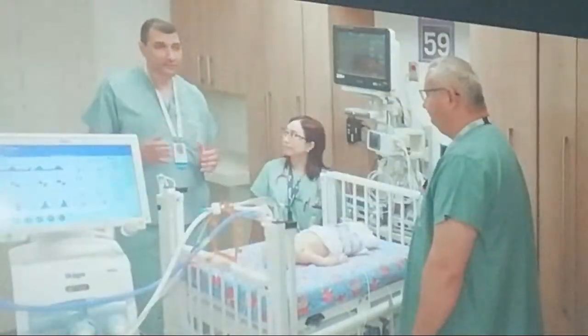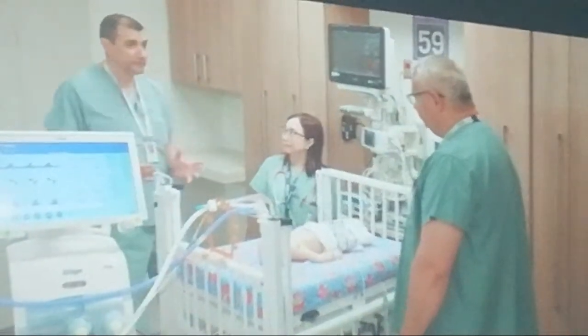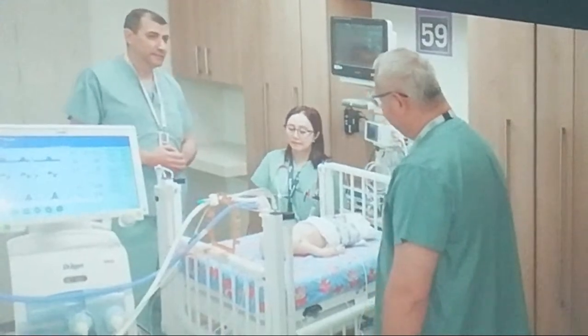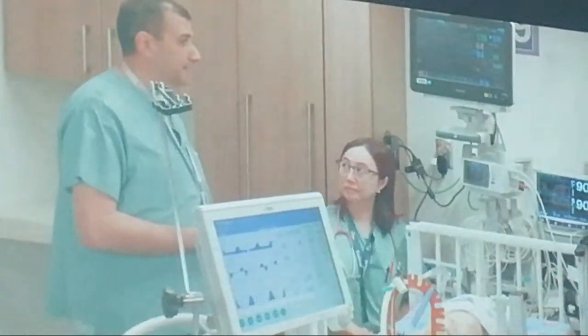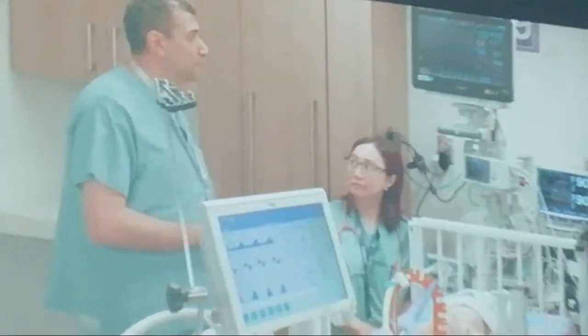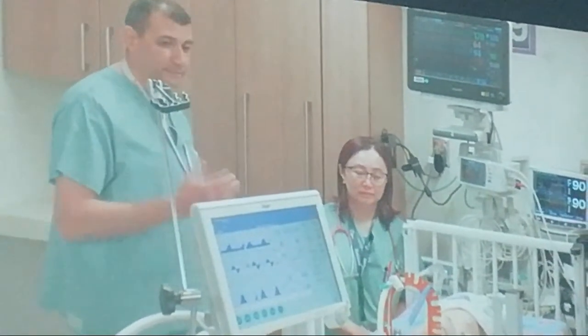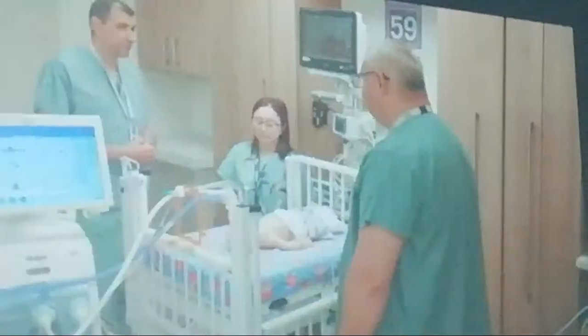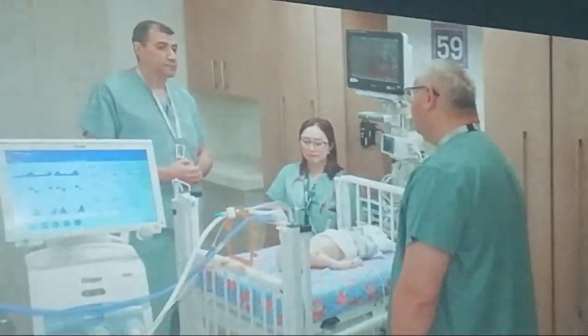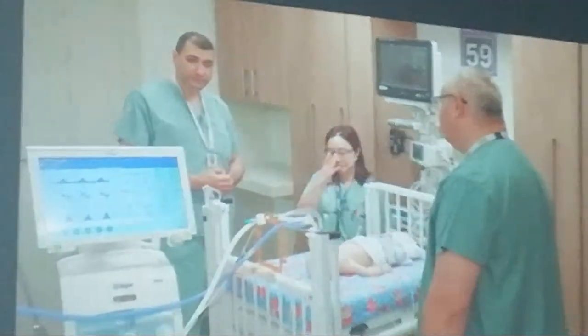It should be between 0.15 to 0.3. So the brain does not extract enough oxygen. And probably we can confirm whether the FiO2 is too much and affecting the brain extraction or not by doing an oxygen reduction test. So we can do it together if you don't mind.